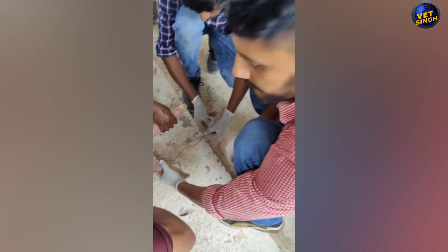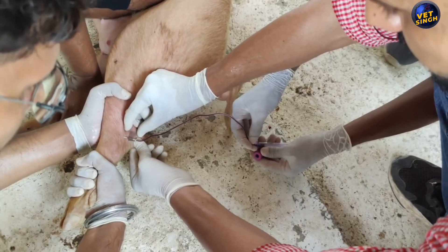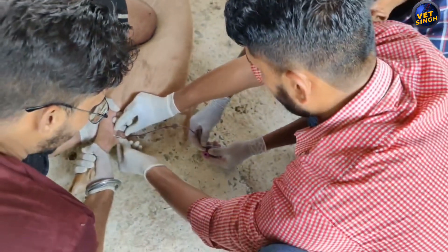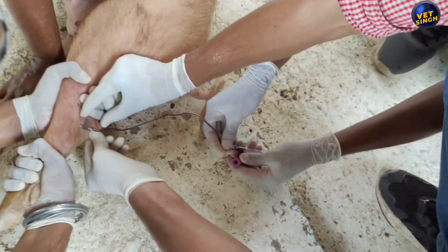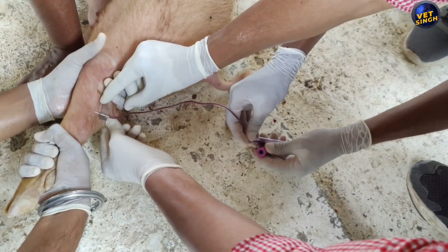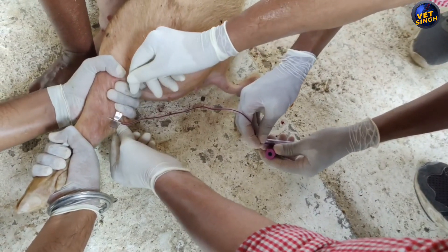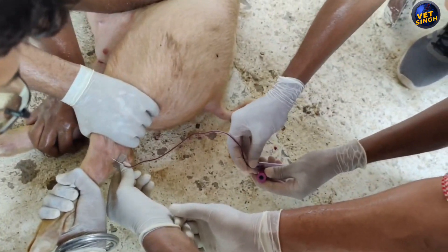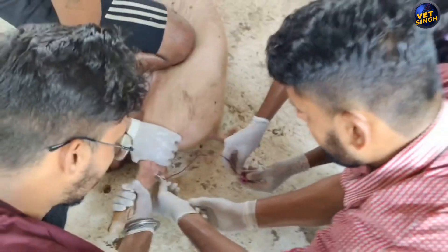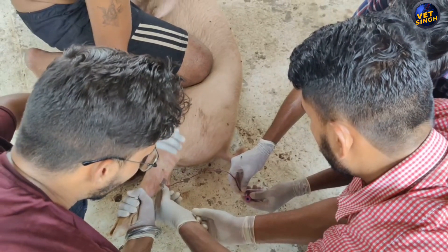Then we poke the vein with the scalp vein set and collect the blood in a 6 ml EDTA vial. We have to restrain the piglet with complete care — do not put additional pressure on the legs and body parts. Keep in mind that we are here to collect blood; do not try to injure the piglet. In between, we pump the leg with thumb pressure and fingers to pump out the blood from the vein.